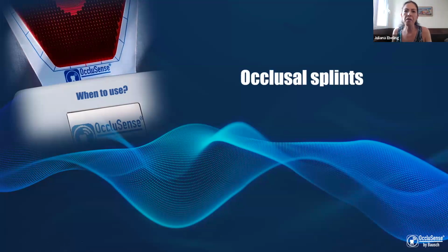This I make with the papers. I don't use OccluSense for that. It's a lot of data to make so many decisions in a dynamic way for this phase. After that, when I finish this adjustment with papers, if I didn't have an OccluSense, I would finish here with papers.